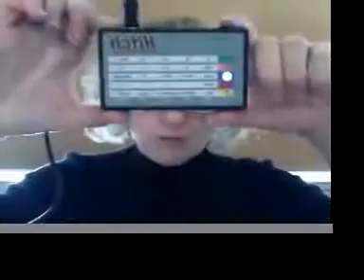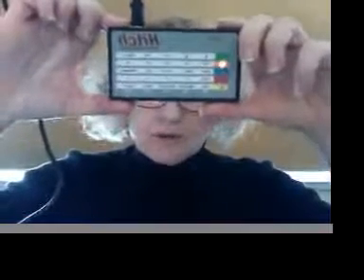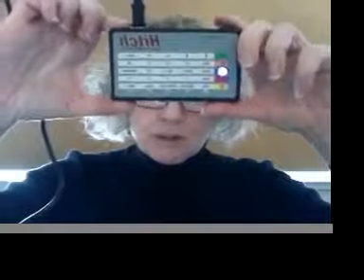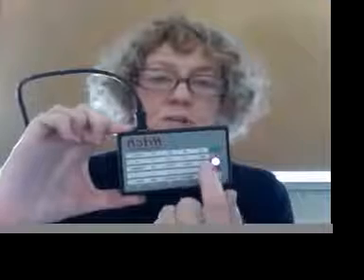So what you do is you press this little button at the top, and you can scroll through the various rows, and in this case we're going to go to the blue row because that's the row that contains the spacebar function. And then you want to plug your switch in to the port in the column that contains the spacebar function. In this case, it's this first port.